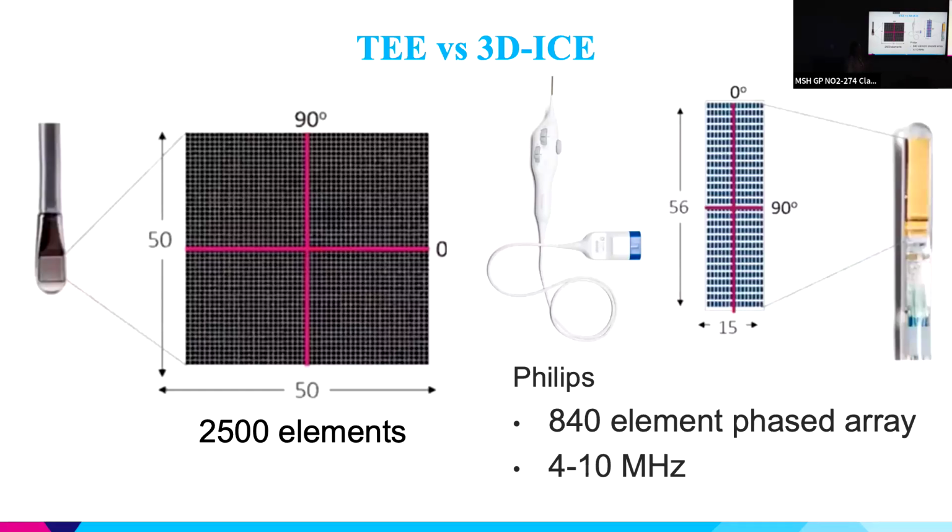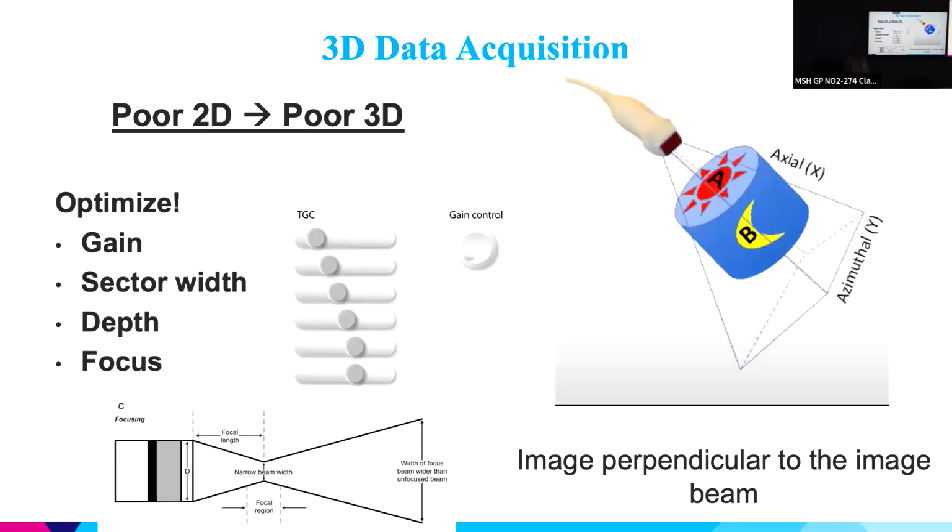The mini TE probe does have the crystals aligned in a grid fashion like this. So the X8 and the X11 are both the same fashion. Lucy, do you know how many crystals are on the X11? I think it's similar. It may be slightly less. I can look that up, I actually don't know. I'm just curious. I think it's similar, but not as great as the X8.